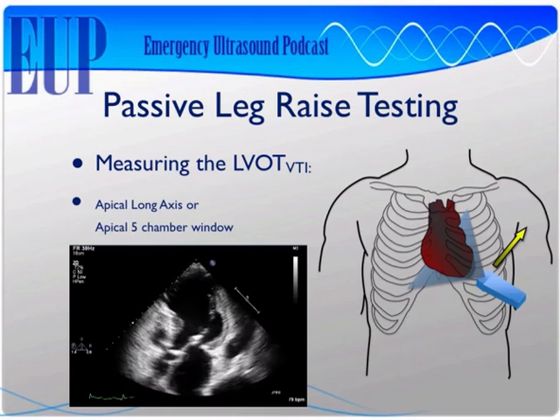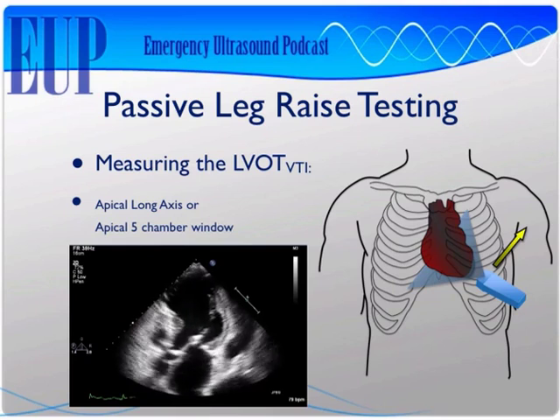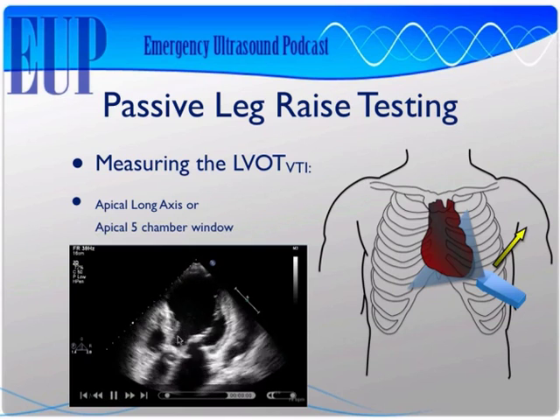Typically, with the apical four-chamber view, I take the probe and flatten it down just a little bit more so that I'm getting a more anterior view of the heart. When I get that anterior view, I bring in the aortic valve. That doesn't require much of a twist, mostly just a flattening of the probe. That gives you this image down here in the bottom left, an apical five-chamber, where I can see that aortic outflow tract, or left ventricular outflow tract, which is right here. This is the area that I'm interested in.